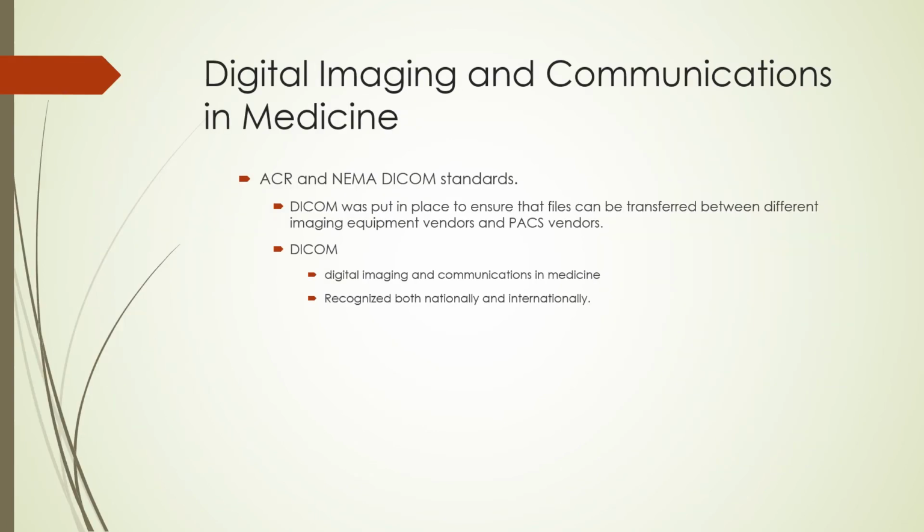Stored medical images are often transferred between computer networks. To allow images to be transferred easily, the ACR and NEMA came up with the DICOM standards. DICOM includes standards for the transfer of images and related information from individual patient studies between imaging devices and storage devices.